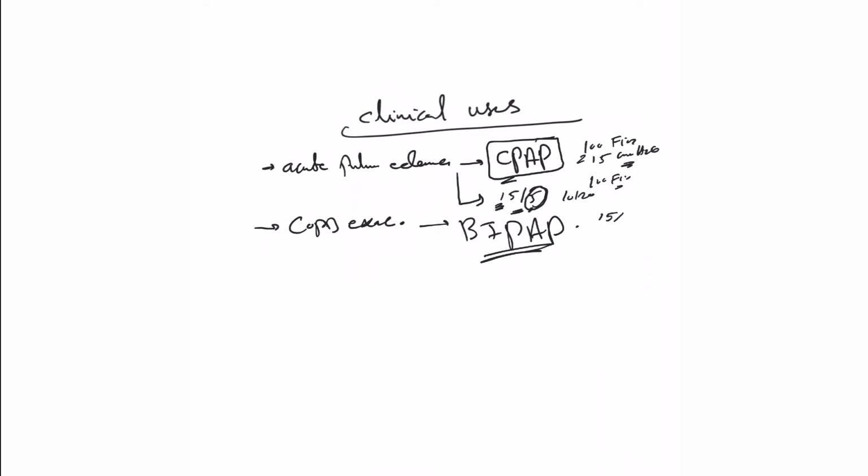And then if they have respiratory acidosis, you need to give them a good delta P. Let's say you start 15/5 or 16/6 or 12/6, and make sure in all cases here, once you diurese them, once they're breathing better, feeling better, you can wean them off that. We'll come to the weaning soon. And make sure you monitor them and repeat ABG in the next hour, 1 to 2 hours. So you need to monitor, make sure they're not getting worse, that they need to be intubated.